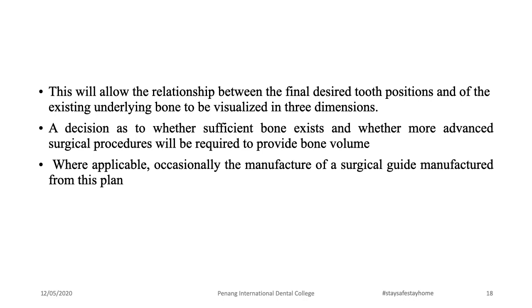A decision as to whether sufficient bone exists, and whether more advanced surgical procedures will be required to provide bone volume. So before you start evaluating whether you can place an implant, a CBCT scan is necessary because it will give you how much bone is available, or the bone volume. If you need any further surgical procedures or placement of extra bone, then you might have to do this prior to your treatment.